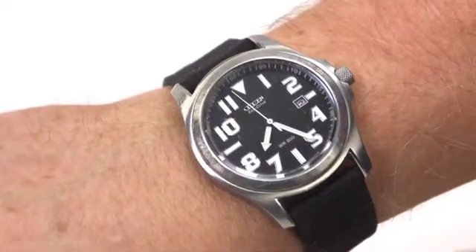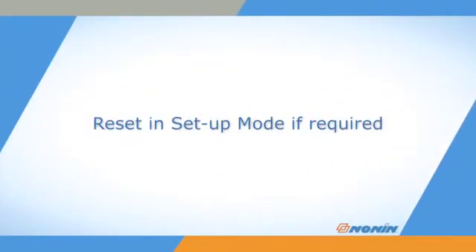Check the oximeter's time and date settings for accuracy during startup, and reset the oximeter in setup mode if they are not accurate or appear as zeros.